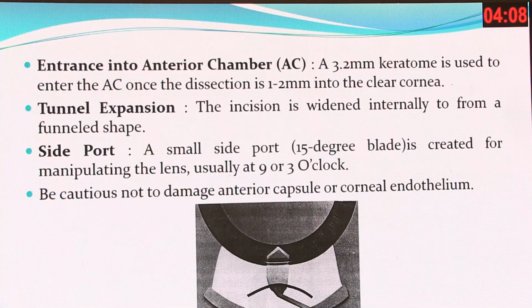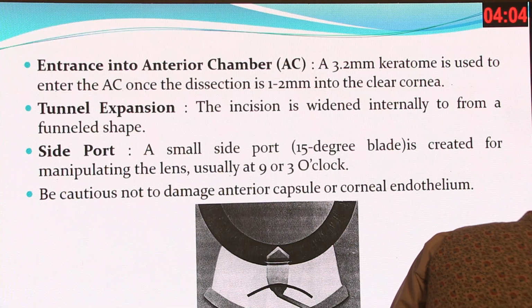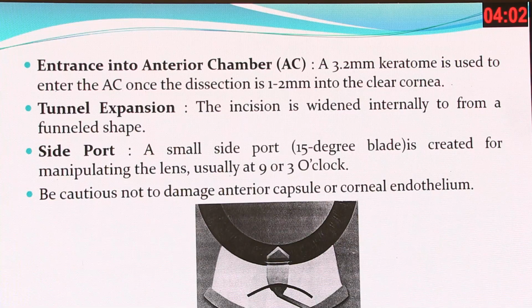Side port: a small port is created with a 15-degree blade for manipulating the lens, usually at 9 or 3 o'clock. Be cautious not to damage the anterior capsule or corneal endothelium.